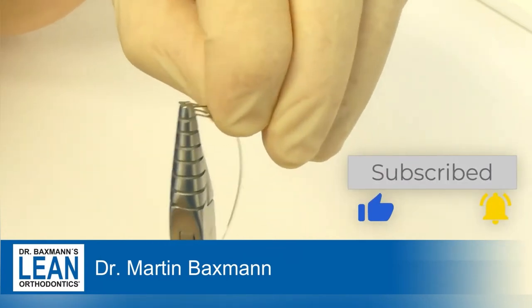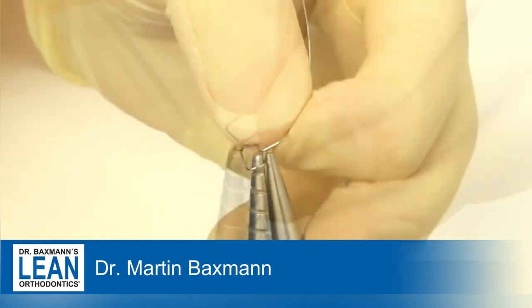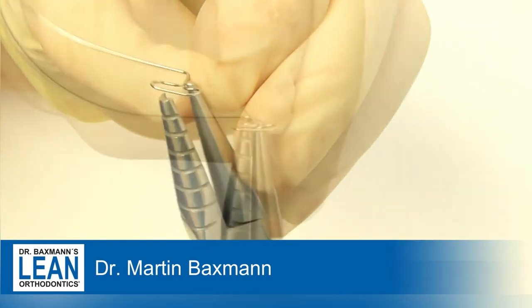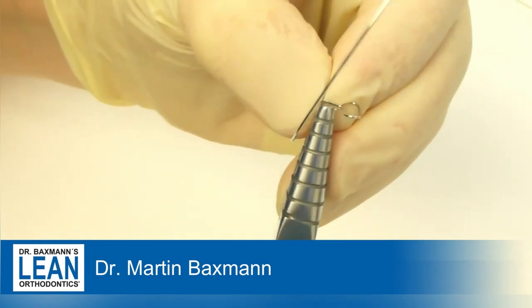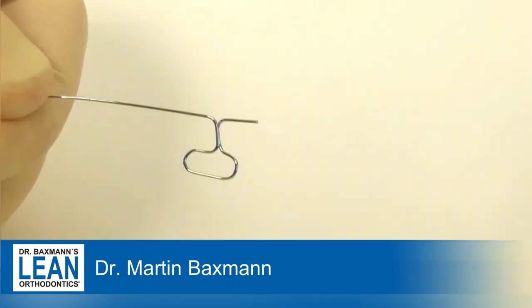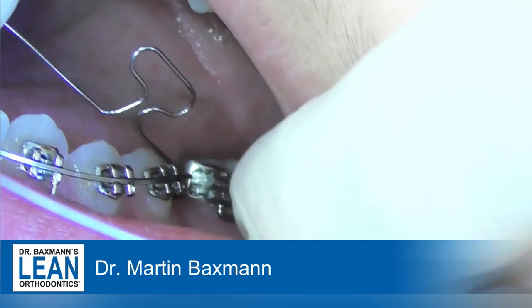We need some extra wire for the end to go into the slot of the 7 in a minute and to be able to bend it back at the back. You will see very shortly in the video. So that's the T loop — a passive T loop.